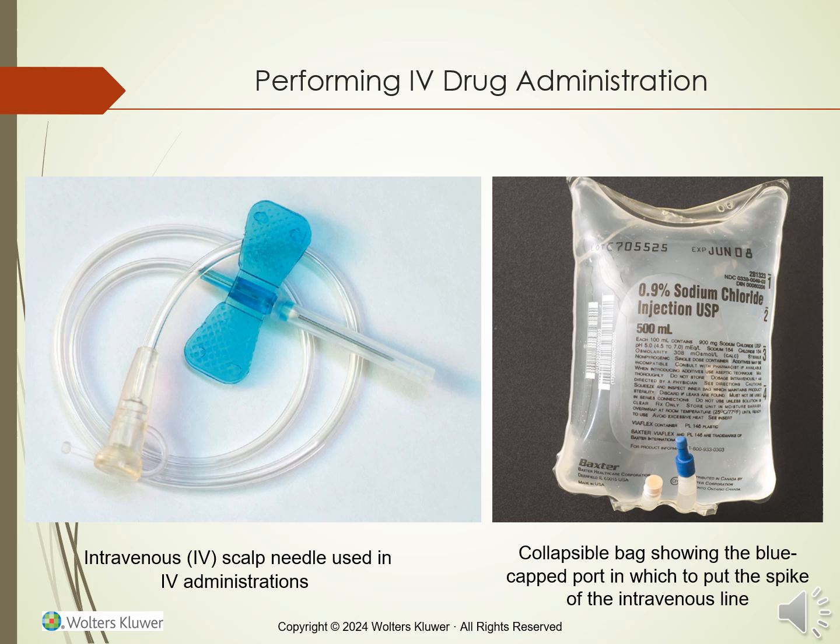And before starting the vein insertion, the infusion setup must be prepped and ready to connect to the needle that you are using. This image shows just a butterfly needle, which would be used for like a bolus injection. And then it also has a bag of a medication. On the slide, it's just sodium chloride. So this is something that would be administered in a larger quantity over a longer period of time.